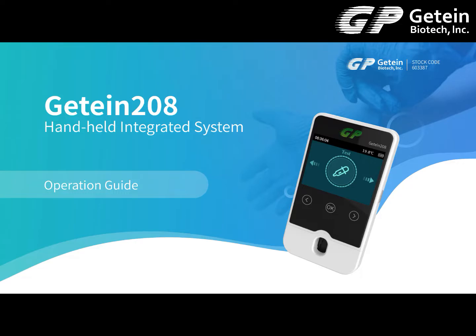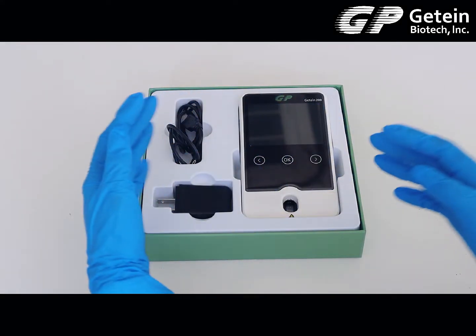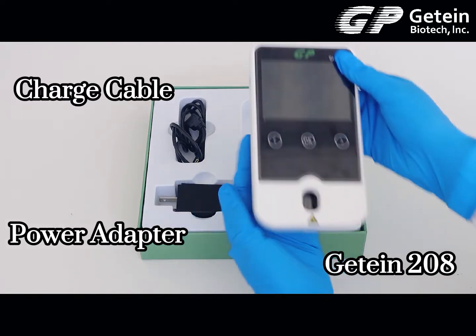Getein208 Hand-held Integrated System Operation Guide. Product components include the charge cable, power adapter, and the Getein208 analyzer.